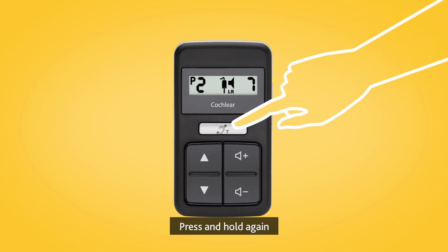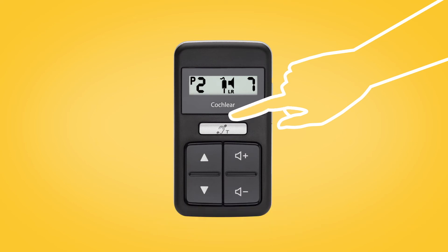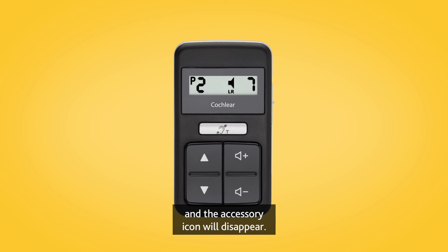Press and hold again to select the next paired True Wireless accessory. To stop streaming, short press the telecoil button and the accessory icon will disappear.